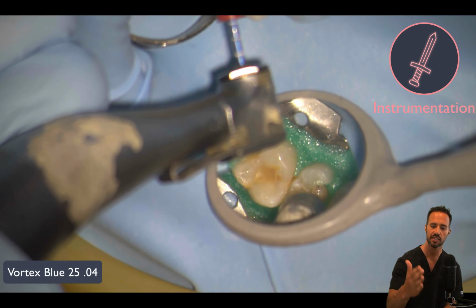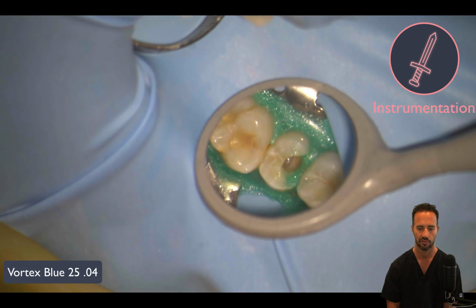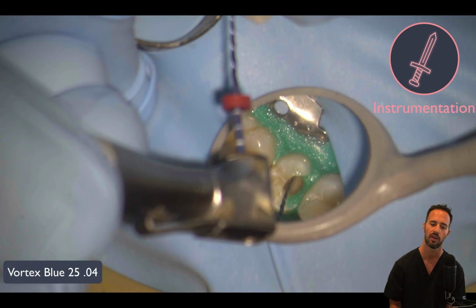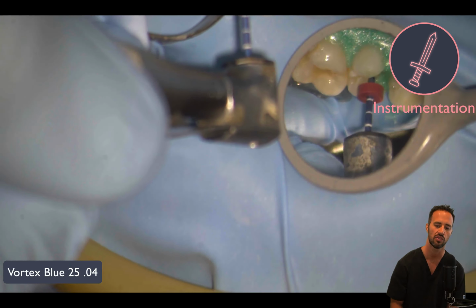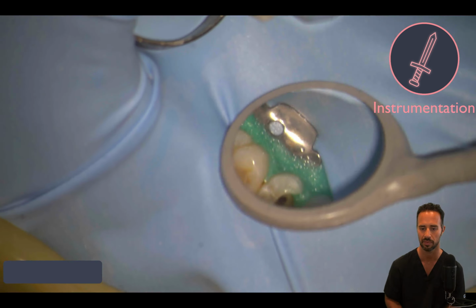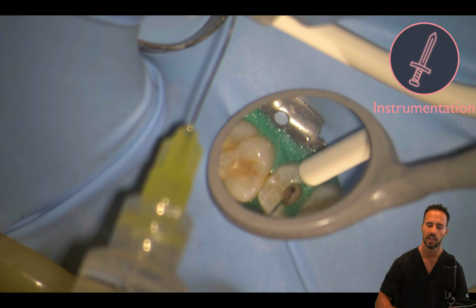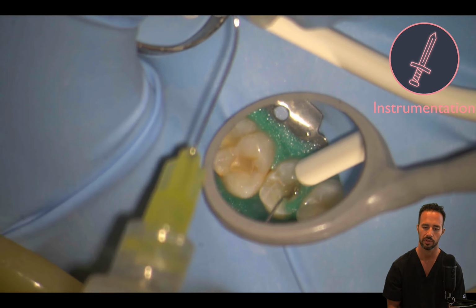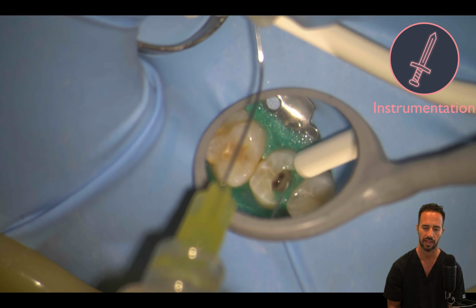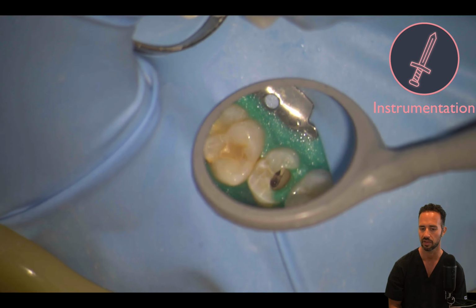And now we're proceeding to our size 25 Vortex Blue .04 taper rotary, first in the buccal, and then wipe, RC Prep, and then into the palatal all the way to length, both at 18.5 millimeters. Okay, we are moving right along. Again, sodium hypochlorite between each file that you pass. And we're working our way up the ladder.